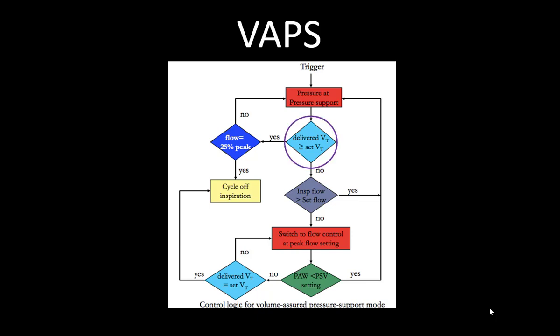So as you can see here, the ventilator tries to manage the delivered tidal volume against the set tidal volume in both ways. If it is less or high, the microprocessor tries to control it by changing the flow, or increasing the pressure limit or inspiratory time. So two variables are changing: the pressure support level and the inspiratory time, both.